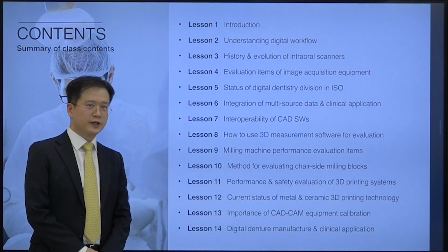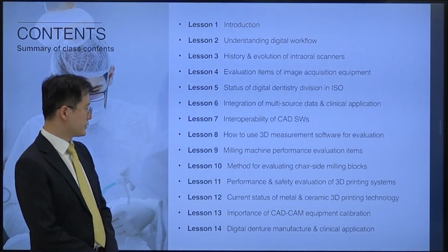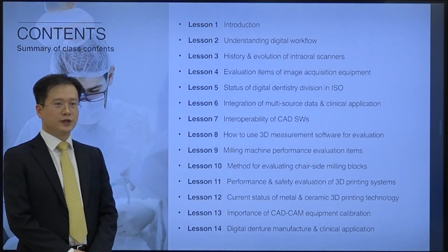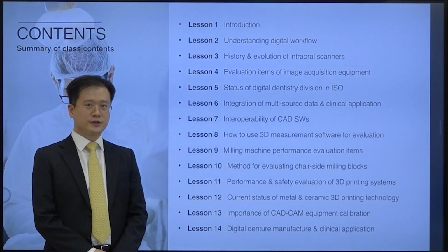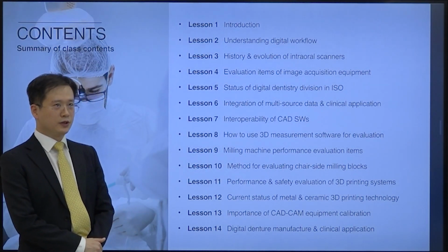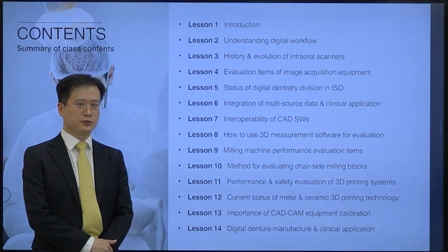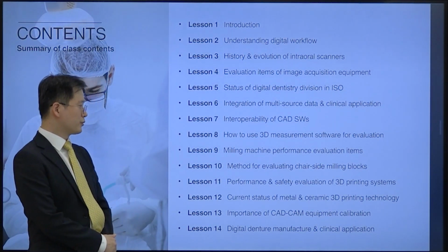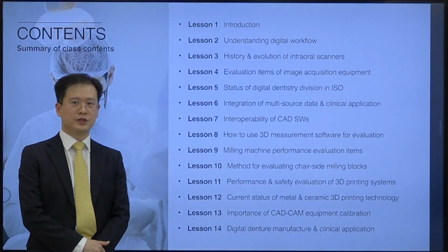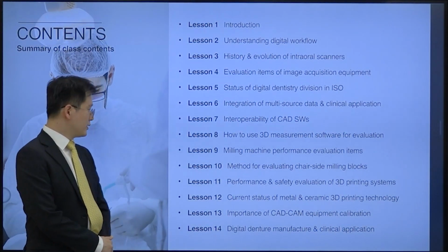Lastly, from lesson 13, I can show you the importance of CAD/CAM equipment calibration. When you are operating a milling machine or 3D printers, we have to do an exact calibration before using those devices, because the resultant devices should fit well in the patient's mouth.